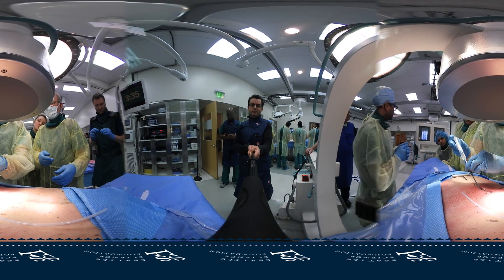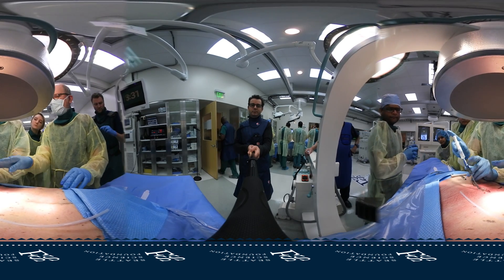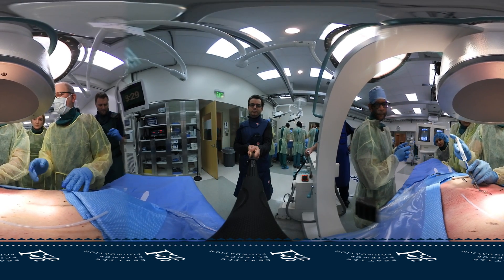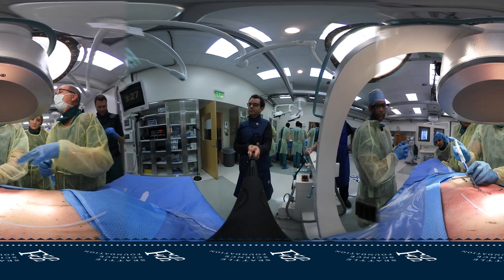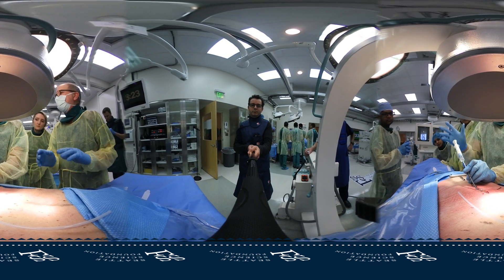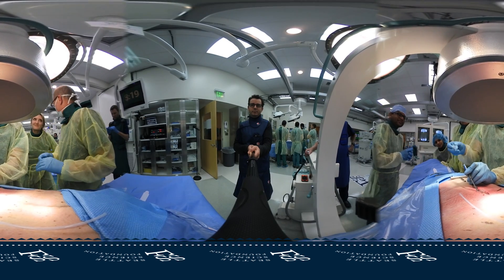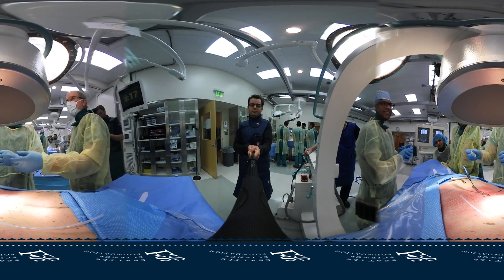Nice resistance, right? This is a good hand position — so if you x-ray, you don't leave your fingers in there. Up like this is bad for your x-ray. Remarkably not subtle, right? This is like the best cadaver on the panel. Was this in two years earlier? Well, I asked for a good one.